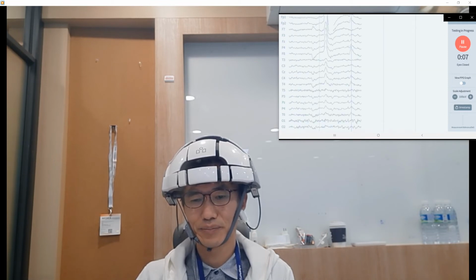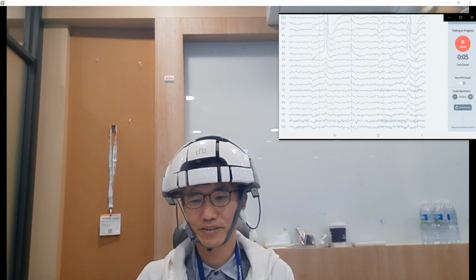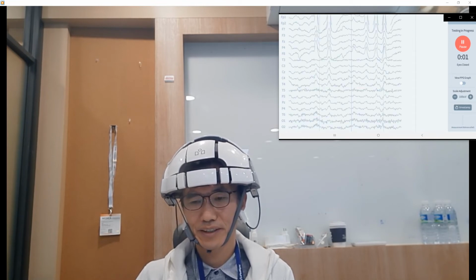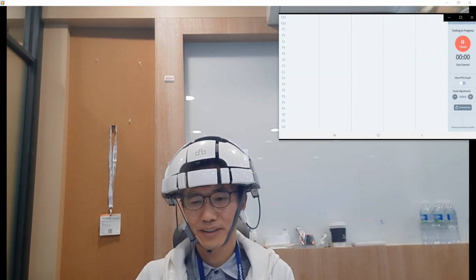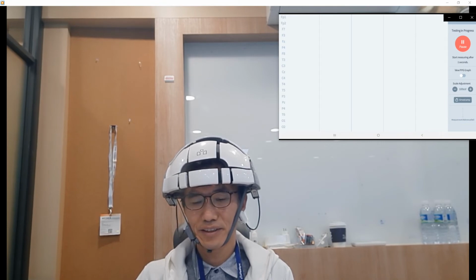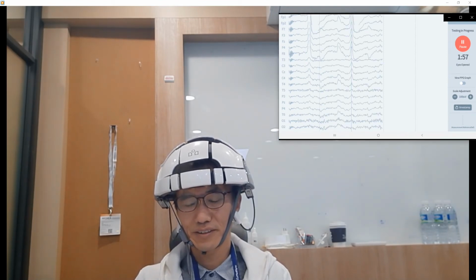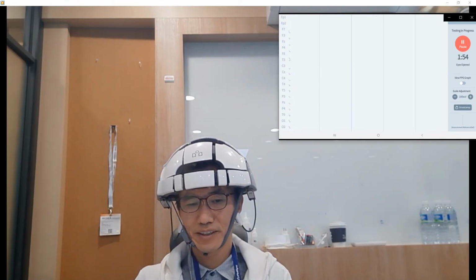You have to make the client keep their eyes closed. Open your eyes. Measuring starts in 5 seconds. Keep your gaze fixed on a certain point in a slightly downward direction in front. In this case, the default setting is 2-minute eyes open recording and 2-minute eyes closed recording.